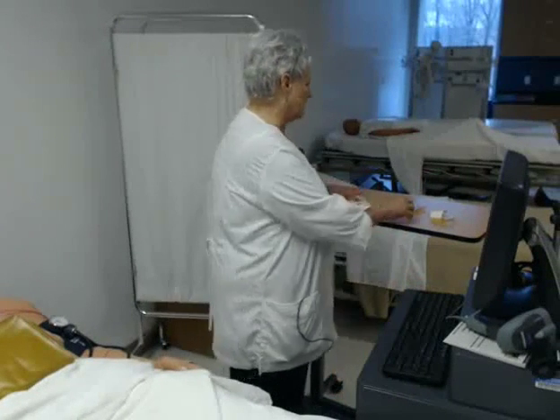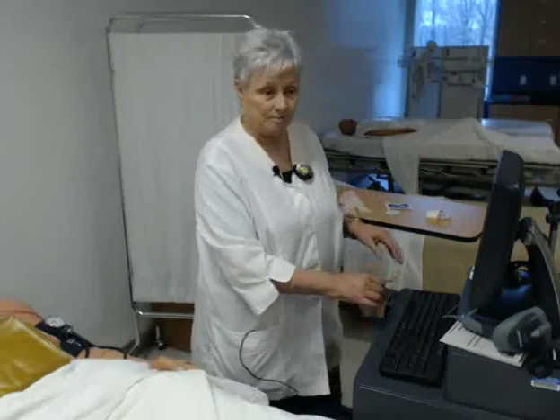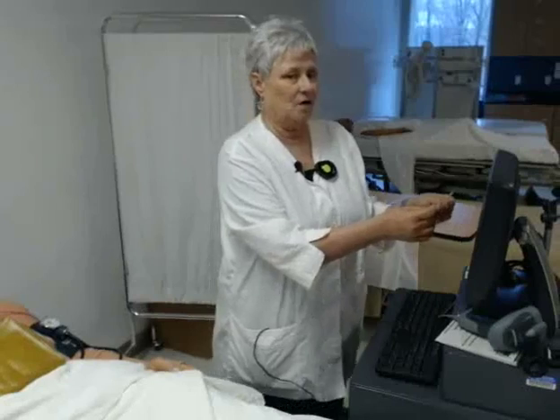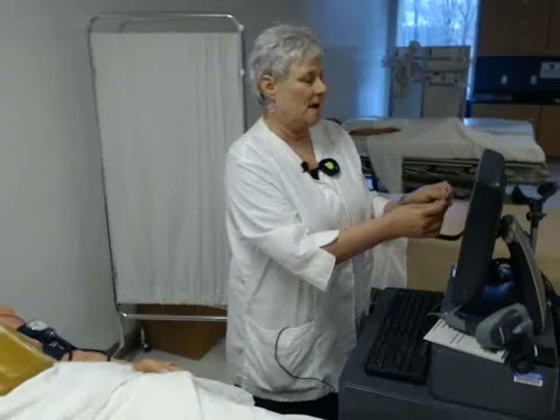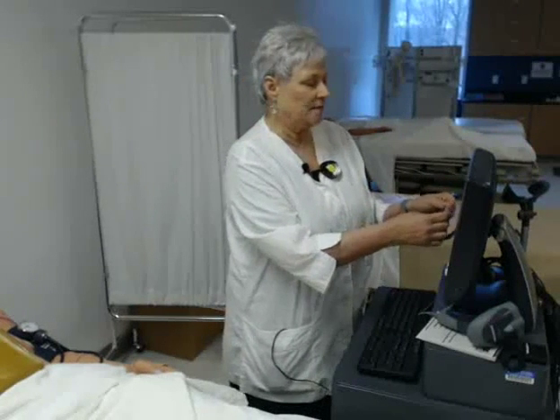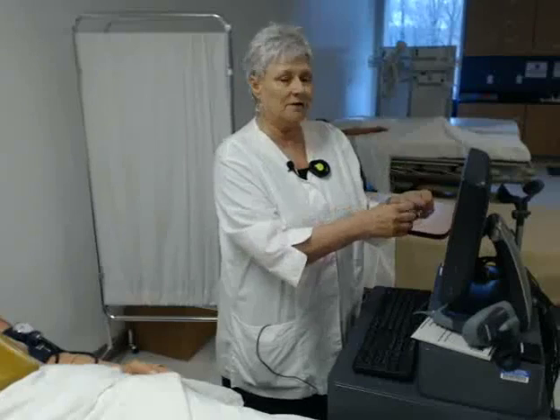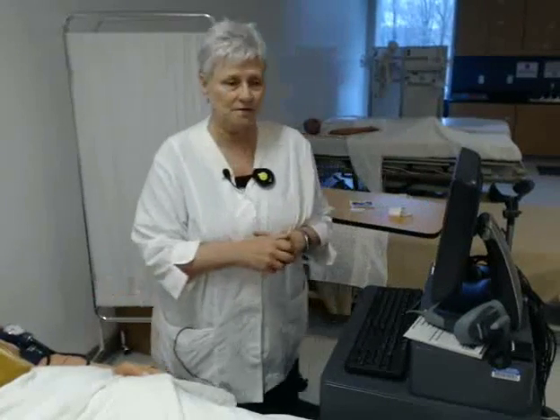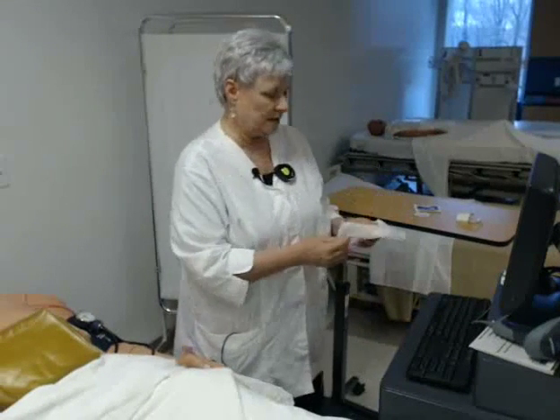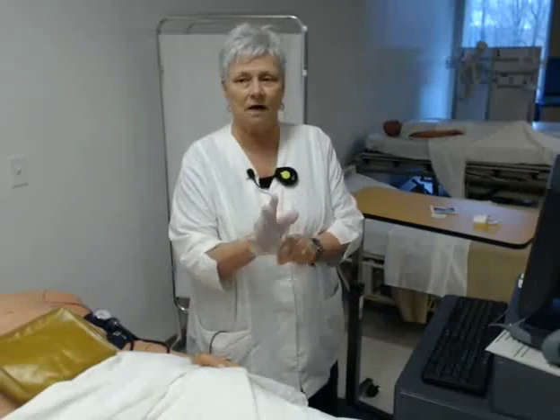So I'm giving an anticoagulant today and I would find it on my MAR and I would pull it out of the drawer. It would be labeled and I would check it all the way across my MAR for all the particulars, then I would check it a second time completely all the way across — so I would check it two times — making sure that this is the correct medication, the dosage, that I know I'm giving it sub-Q, the time, and everything I need, all the rights. And I've verified that this is the right patient. After I've checked it two times, I want to be sure that I'm ready to go in and give the injection, and I've done my hand hygiene or washed my hands.